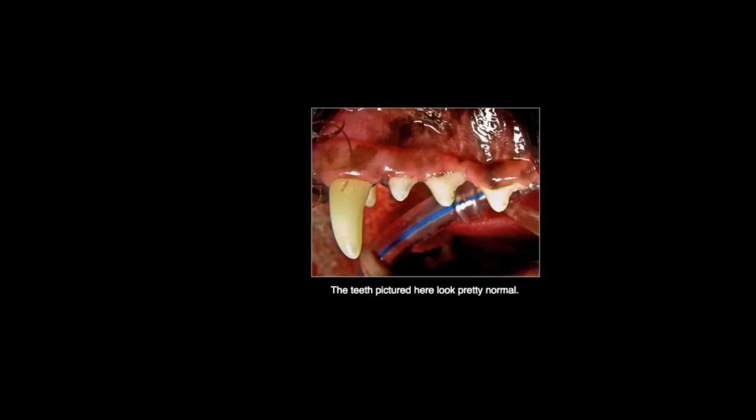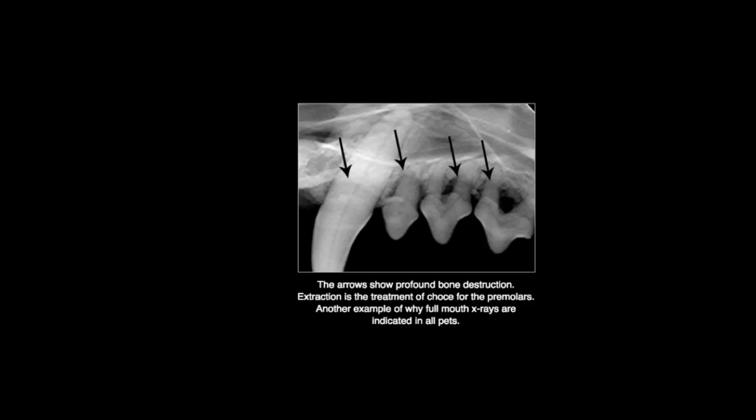Here's another example. This is a very common situation where we don't have a lot of gross pathology, however when we look at the same area radiographically we see that periodontal disease has destroyed a lot of the bone around these tooth roots. This is an excellent image set to explain to clients that the majority of the pathology present with periodontal disease is not something we see — it's actually what we don't see — and it's very effective in gaining compliance with periodontal pathology.